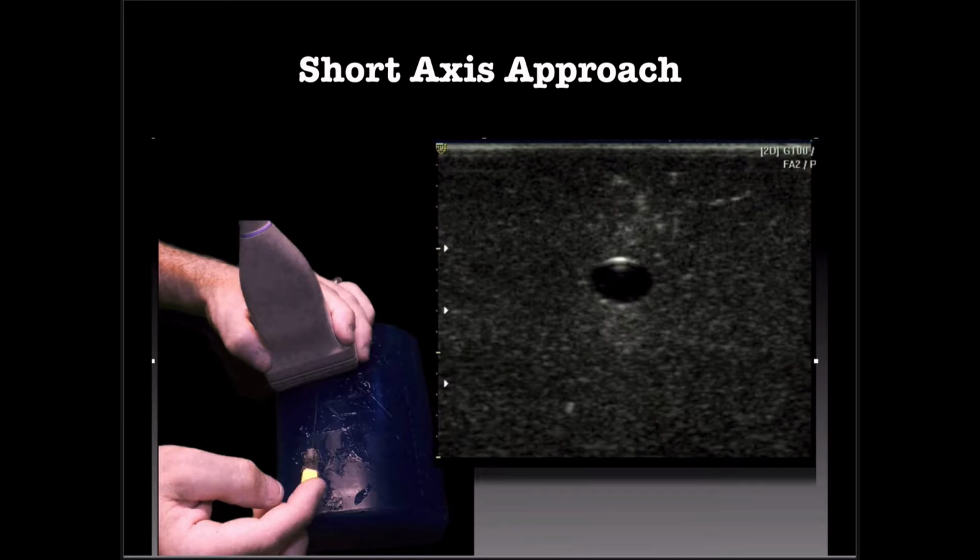Transducer, needle. Redirect if you need to. Transducer, needle, transducer, needle. It's a stepwise approach. It's a step at a time, going right down those CT scan slices until you got your needle in the direct middle of your vein.